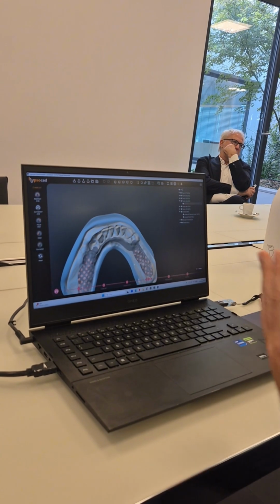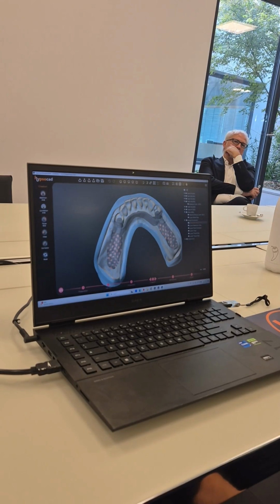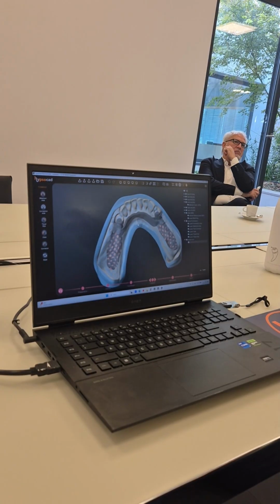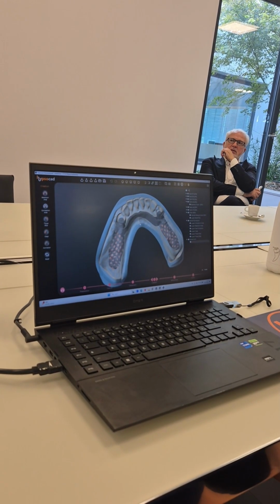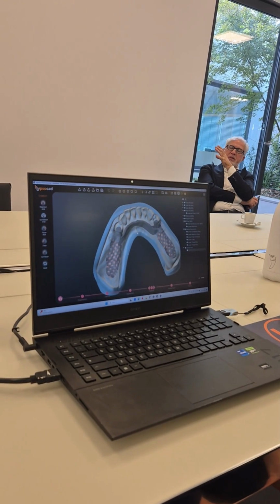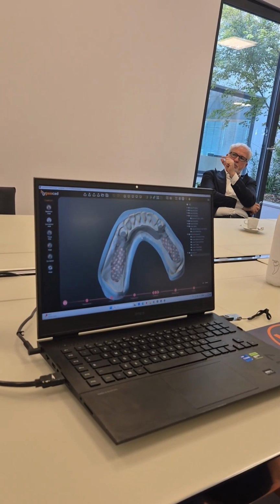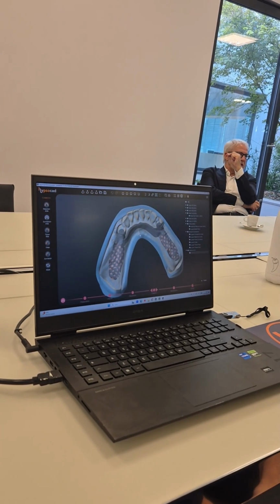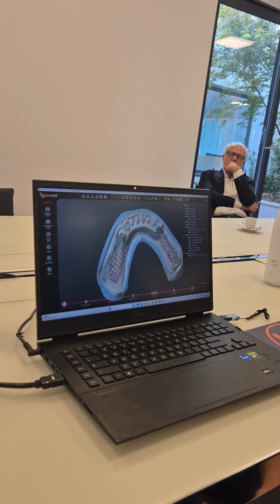Do you know if now Exocad is different, or has better development? Yeah, there is a new workflow for this in our software. If you want, I can show you a real case. They did something anyway, they tried to do something better here. They announced last year the possibility to split the skeleton with the upper part, the combined prosthesis. Exactly. They are working on that, of course.